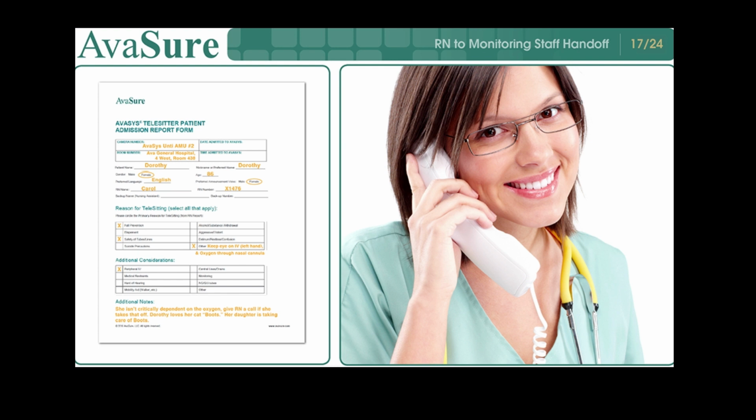Some additional information that you can pass on to the next monitor tech is that she isn't critically dependent on the oxygen, so just give me a call if she takes that off. Her daughter told me that Dorothy loves her cat Boots. Her daughter is taking care of Boots while Dorothy is in the hospital.